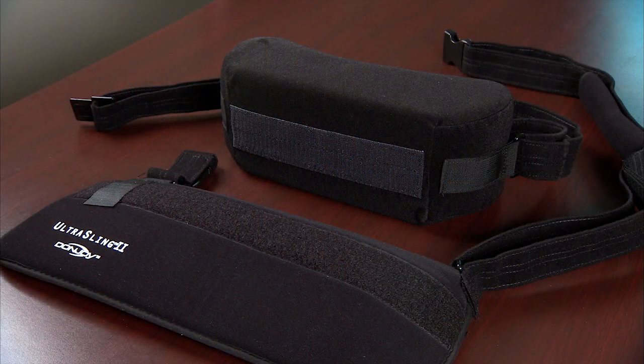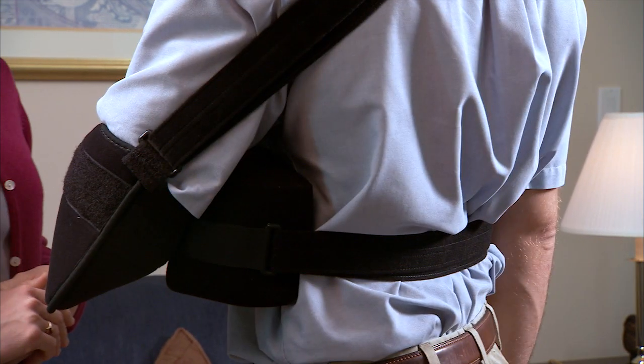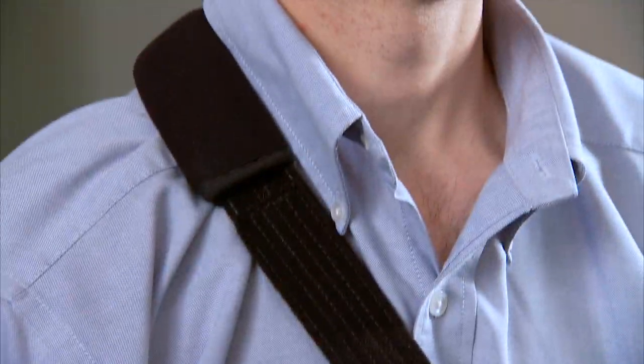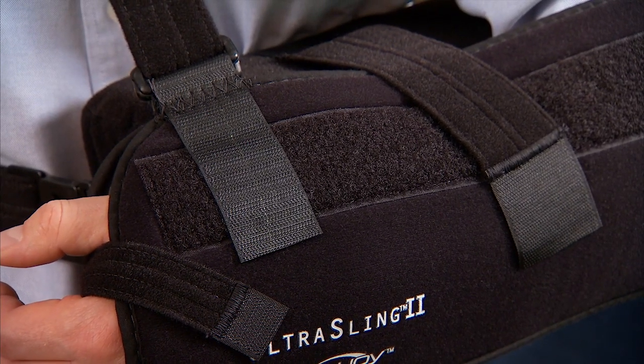Shoulder abduction slings are available from several manufacturers. We'll demonstrate how to put on this model. A pillow is attached to the sling to hold your arm the proper distance from your body. One strap on the sling goes around your waist, another goes around your neck. Shorter straps are attached by Velcro to help keep your arm in the sling.